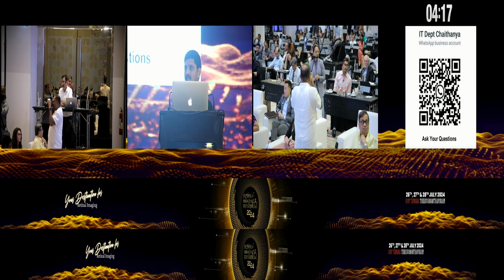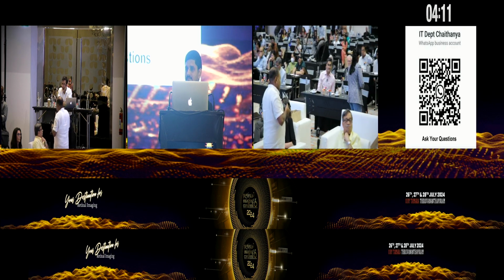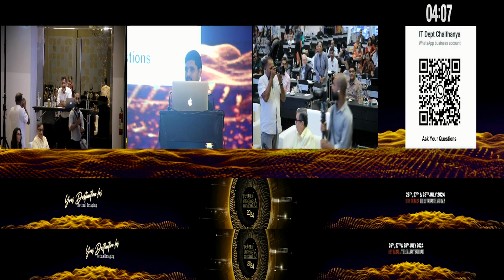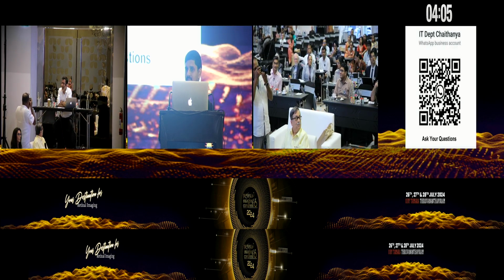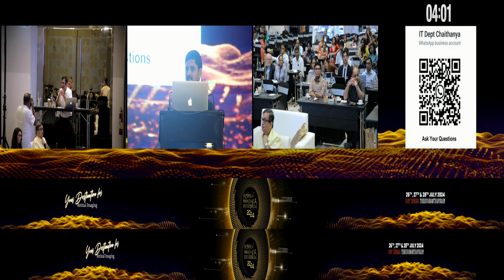Yeah, I will take Kelvin's opinion on this. He has been doing this for quite some time. I know that we all struggle with looking at the DLS, especially I get lost when I'm dealing with basal laminar deposits, and you are not sure whether there is thick RPE, or there are deposits, or there is still a persistent MNV. So Kelvin, how do you follow these patients with outer retinal changes that Apurva brought up?